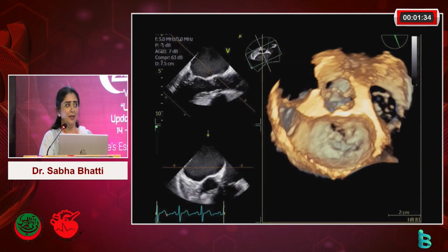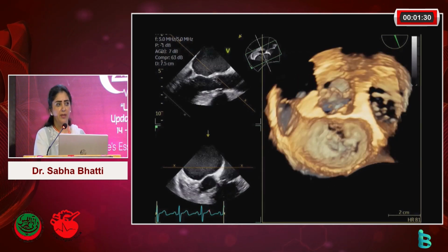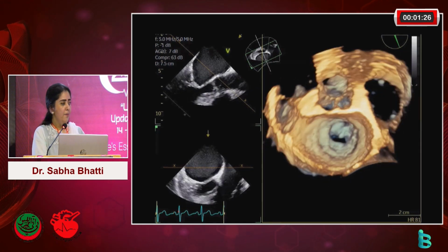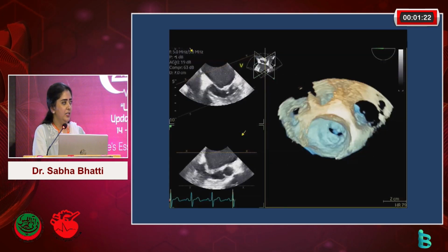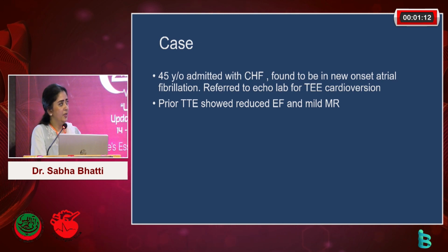So sometimes in your labs where you work, you might see some discrepancy: the mean doesn't match with the area, or the area is too high and the mean's too low. Make sure that your sonographer cut it at the tips or get a 3D TE. And not all cases of mitral stenosis get a TE, but these are examples of cases that were being considered for balloon commissurotomy, balloon valvuloplasty.